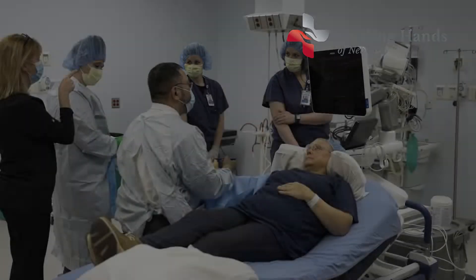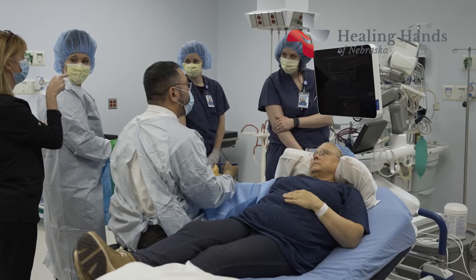I'm Dr. Demetrio Aguilar, and today I performed the very first trigger finger release with ultrasound guidance in the entire state of Nebraska.